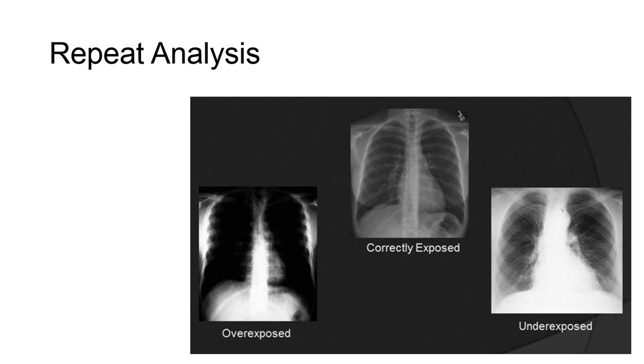This is something I would advocate for in a radiology department when the purchasing of equipment occurs, as being aware of the repeat rate provides data to improve technologist performance and reduce radiation exposure to patients.